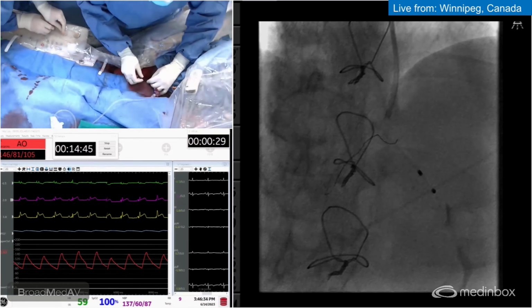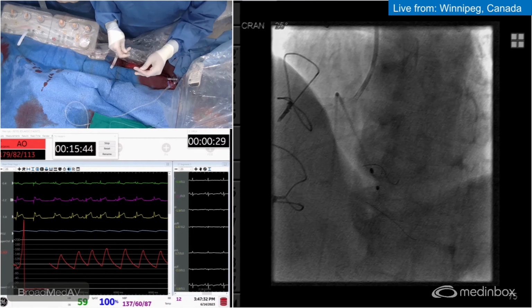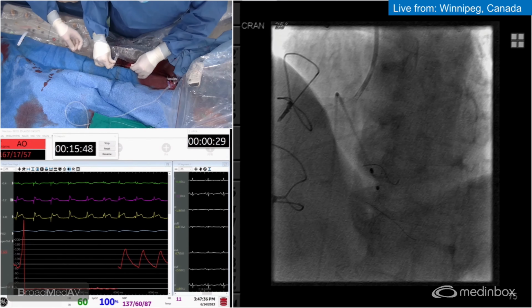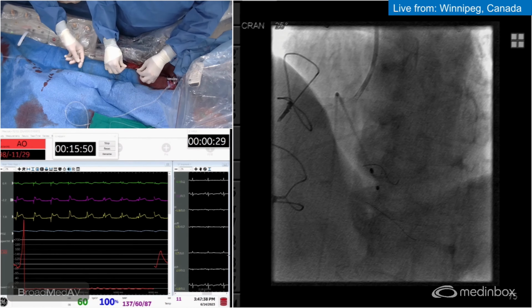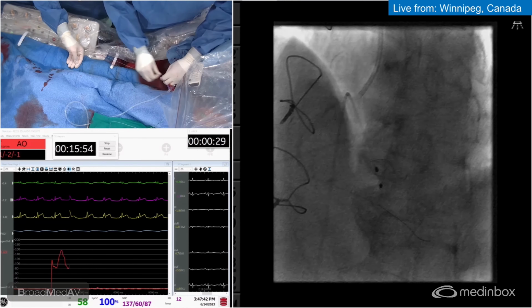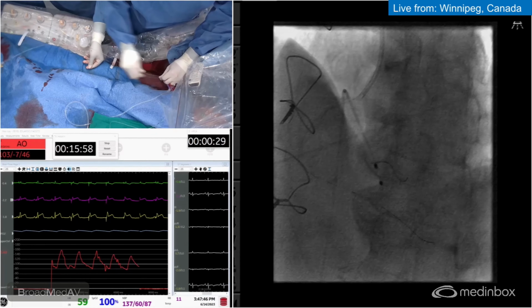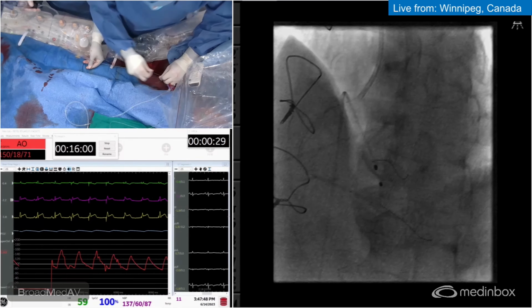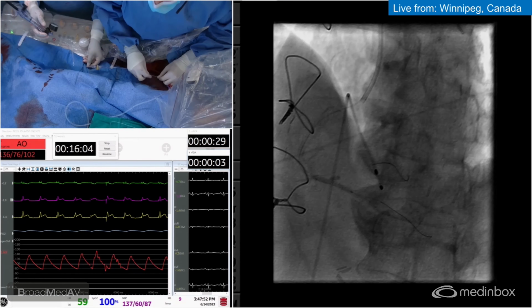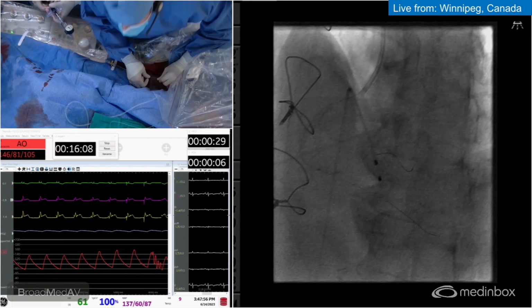Puff there. So we did very aggressive ablation here with the 120. So if it still doesn't crack with an NC balloon, then the next step would be to go up there. So we're just ballooning the PDA, proof of flow down there. It's 12. And that is expanding well. So that is not an issue. So that makes life easier. Good. Down 12. So STs are getting better.